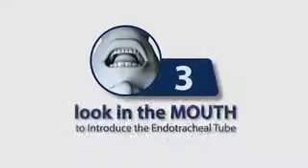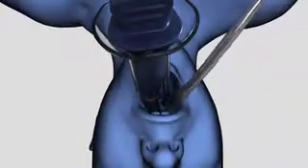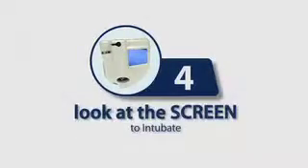However, in Step 3, it is very important that you look directly at the patient's open mouth and not at the video monitor, watching the passage of the endotracheal tube to help avoid potential injury to the tonsils or soft palate. The endotracheal tube, which in this case is shaped by a Glide-Rite rigid stylet to complement the angle of the Glidescope videolaryngoscope, is inserted under direct vision until the distal tip of the tube is very near the distal tip of the laryngoscope. This relationship is quickly and easily achieved, and only then should you return to looking at the video monitor.